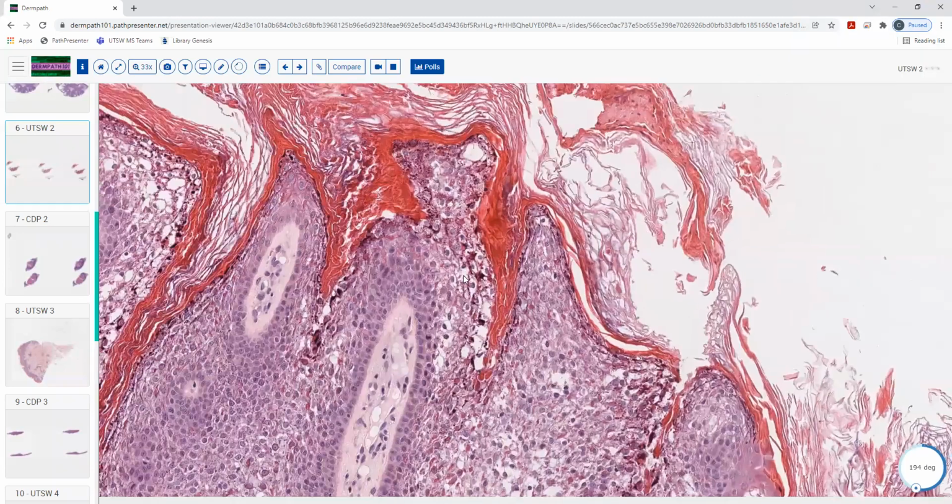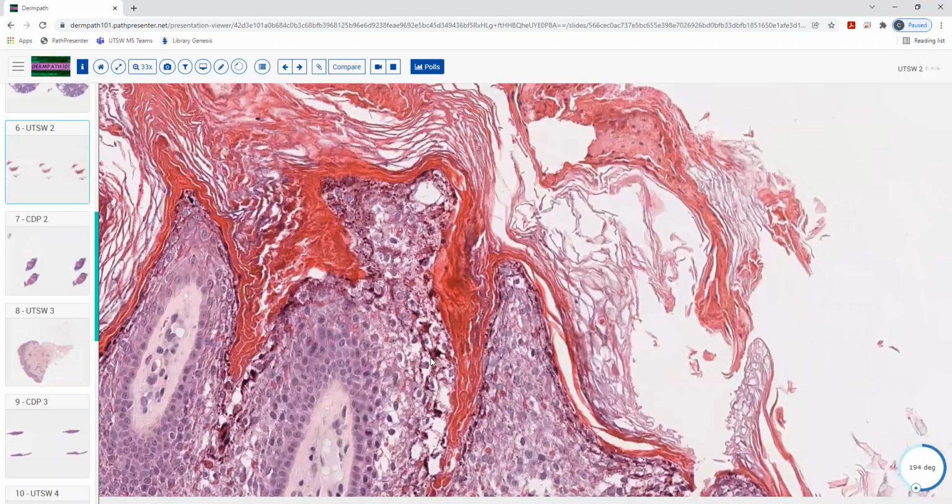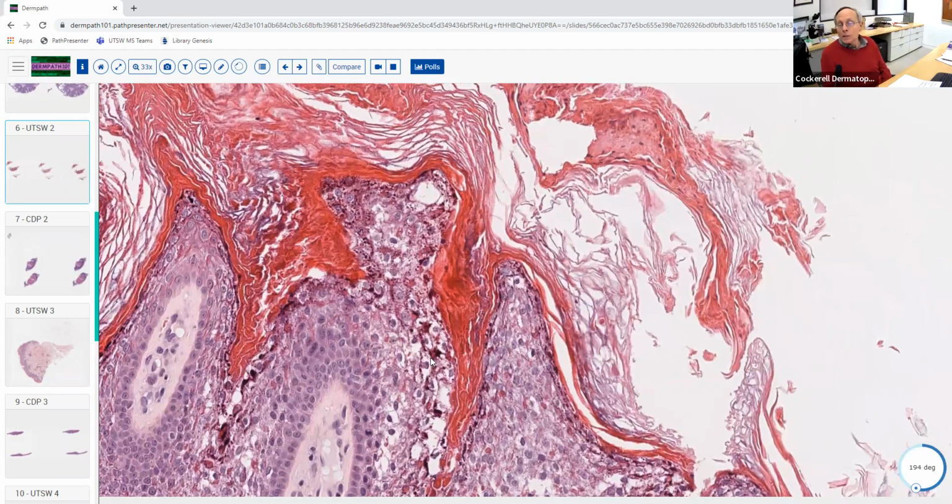I think the other one is like an epidermal nevus. Yeah, good. Absolutely. Systematized epidermal nevus. And basically what's going on there is the same germline mutation that you get with epidermolytic hyperkeratosis, the widespread form. It just happens to hit a dermatomal area. So it's a post-zygotic mutation in that situation, but you biopsy it, it looks like this.